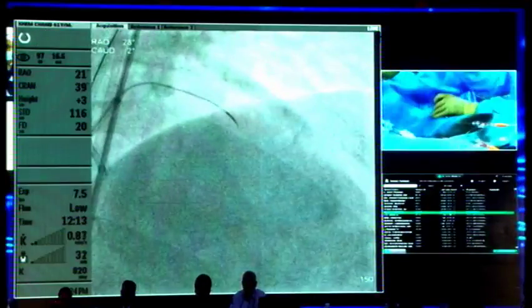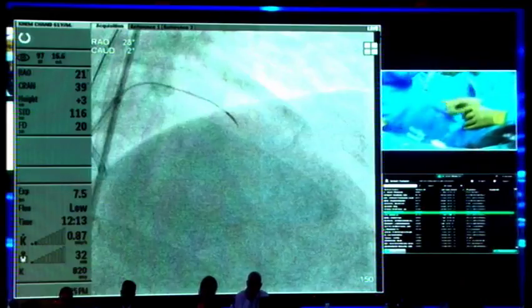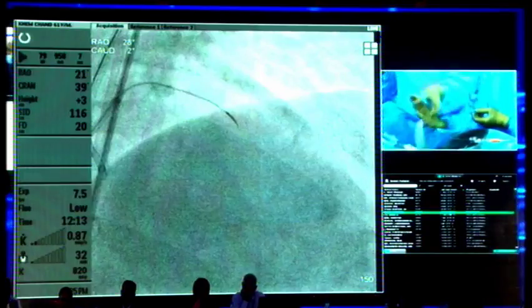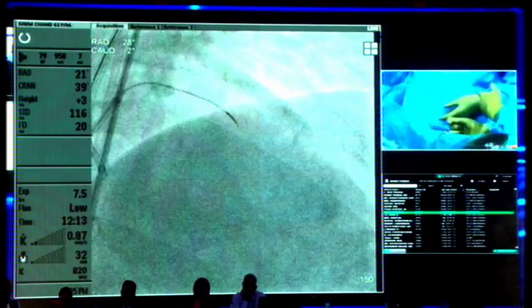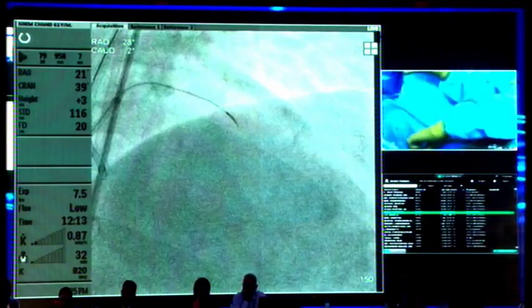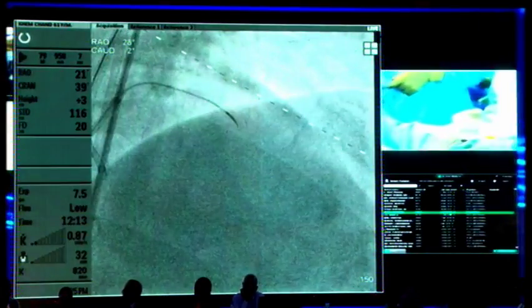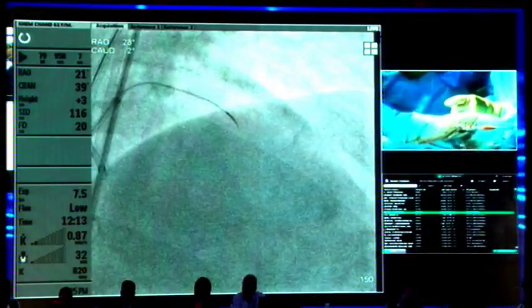Okay. Gaia Next 3, yep, thank you. So we may need very, very careful wiring, because the target is very small, and if we miss, it's better to go to the retrograde. Thank you. Okay, lights on. Lights, yep. Hopefully this can go smoothly into the distal vessel.